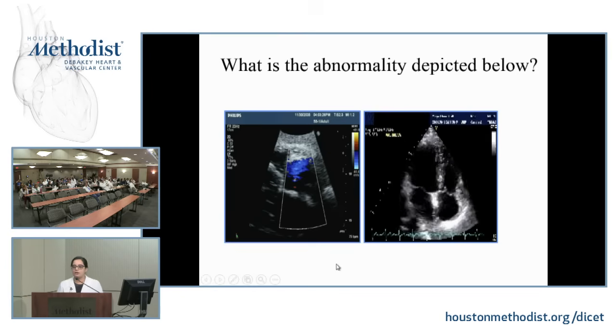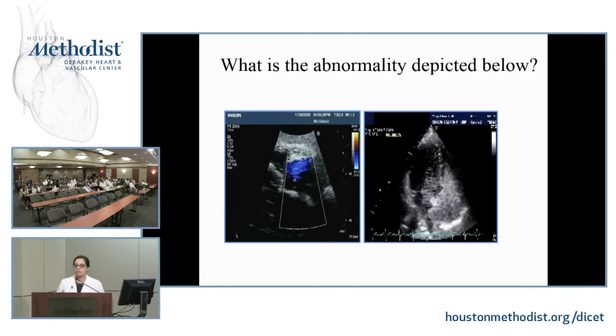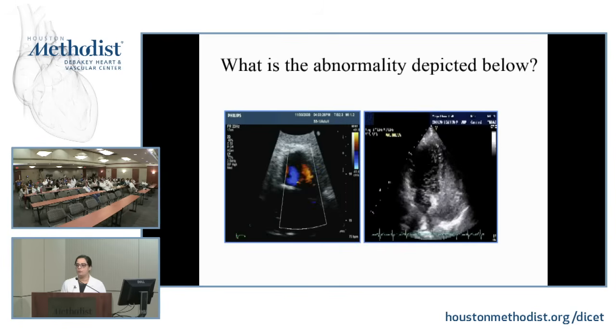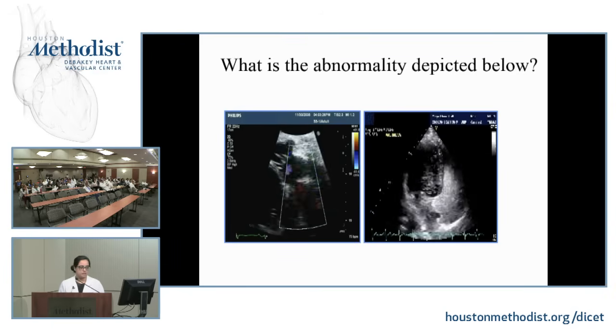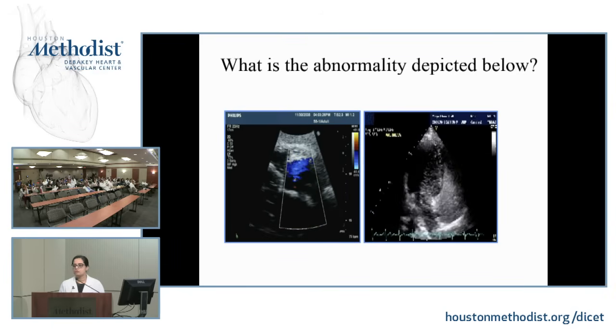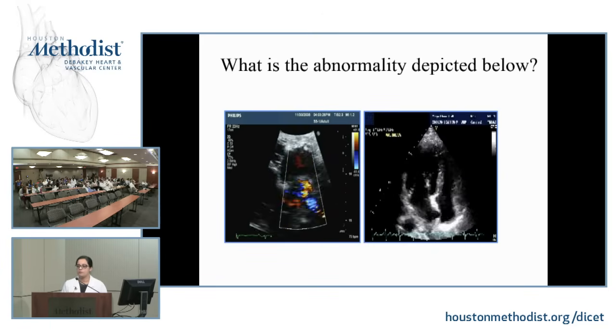And at the time of the post-surgical phase, it just became more profound with RV failure, and the patient was just hypoxemic, and everybody's freaking out. But once we did the study, we found that there's a PFO, which is also another important finding. We should look for it pre-LVAD. I mean, we always do, but this is an example of how it was missed.